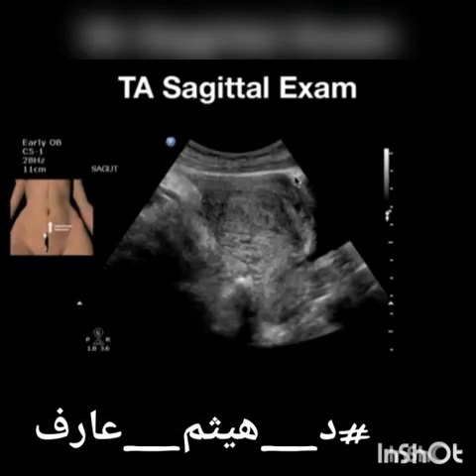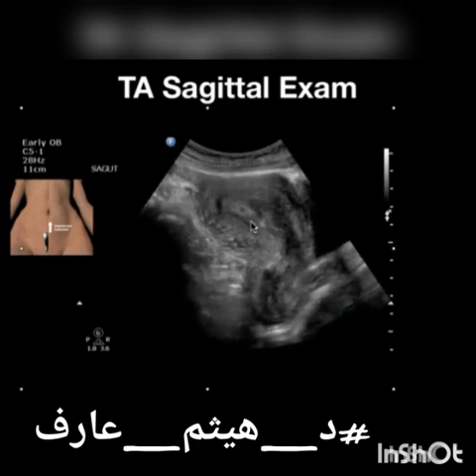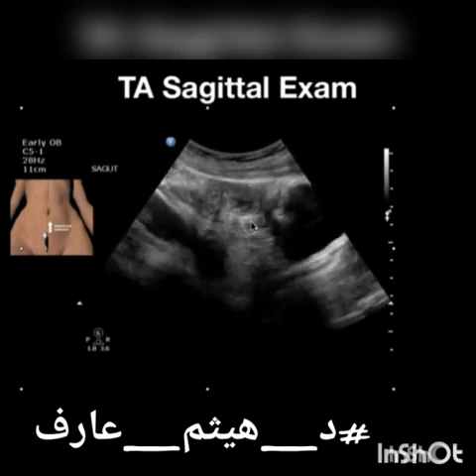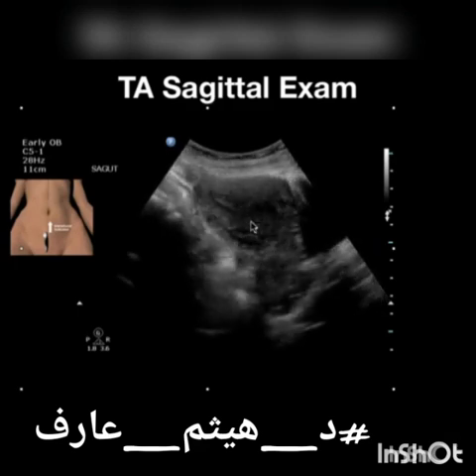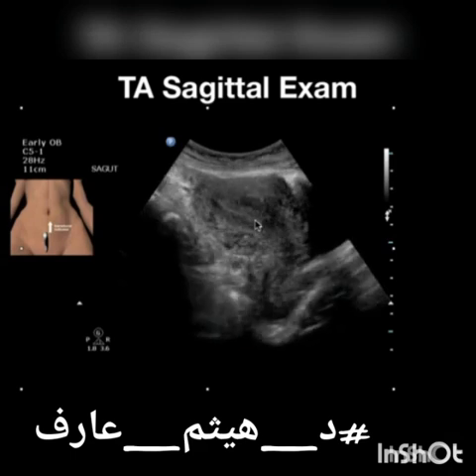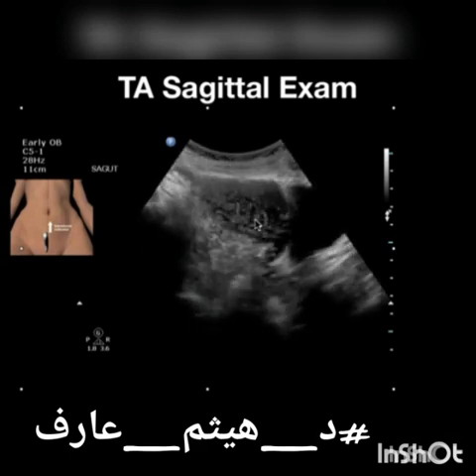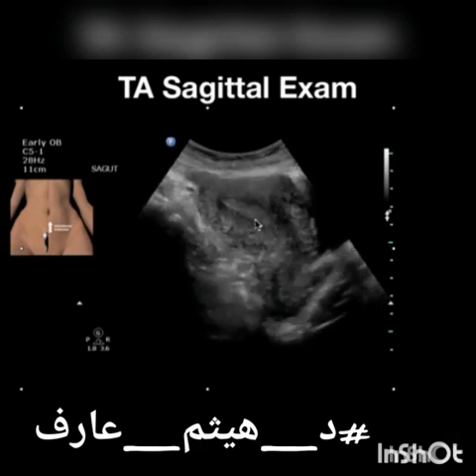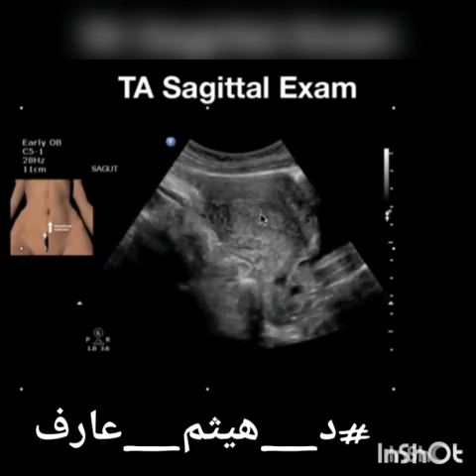Here's an example of a transabdominal sagittal exam where we sweep from side to side, surveying the entire uterus. So you can see we're sweeping from one side of the uterus to the other. And again, you can see here on this uterus, the uterus is anteverted here. You've got urinary bladder. Here's vaginal stripe.